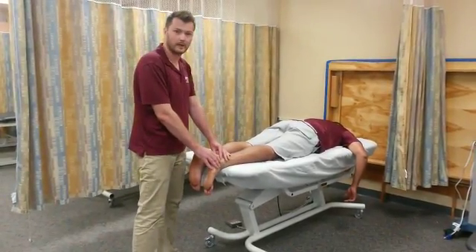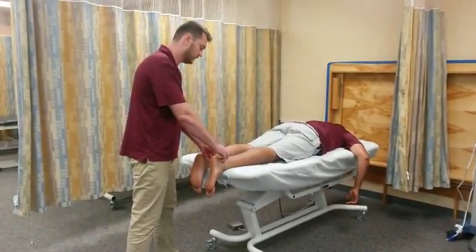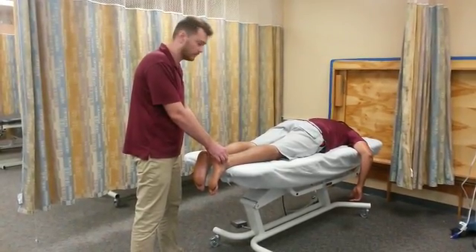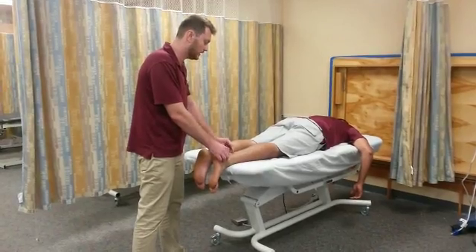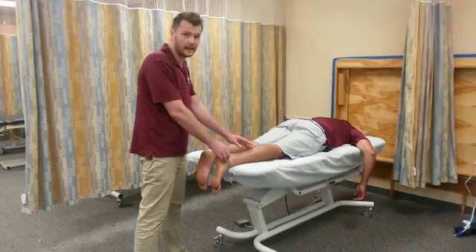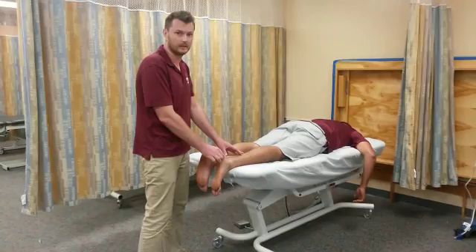Then I'm going to return the patient to the resting position and palpate the anatomical landmarks. The fulcrum is going to be the posterior midway between the malleoli. For the proximal arm, it's going to be the posterior aspect of the tibia, or lower leg. And for the distal arm, it's going to be the posterior aspect of the calcaneus.